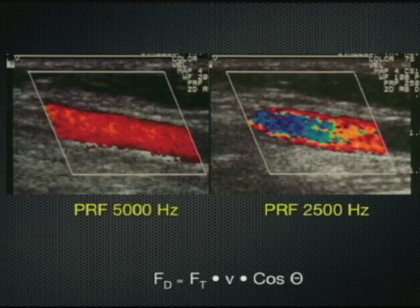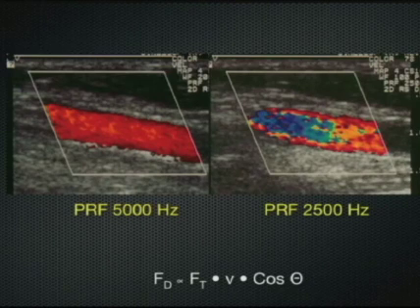And here's an example. Here are two views of the common carotid artery. The only thing that has changed in these two images is the pulse repetition frequency.